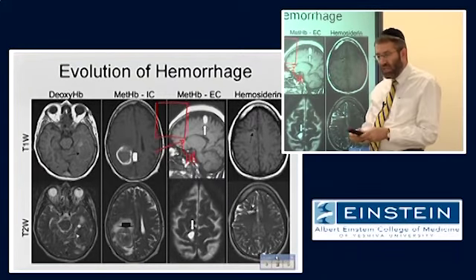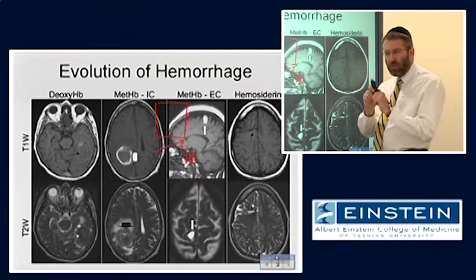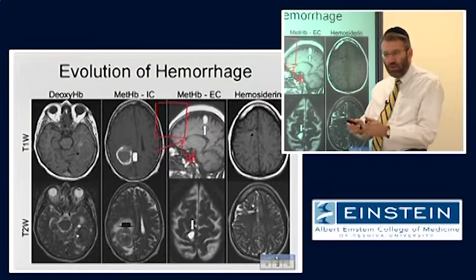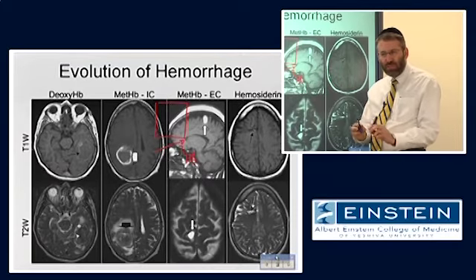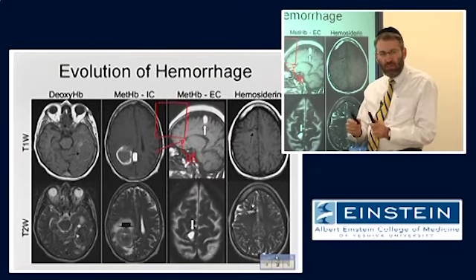And that assumption is that during that entire period of time, from when we generate the signal through the initial dephasing, 180-degree RF pulse, and the rephasing, that these experience the same difference in magnetic field strength.